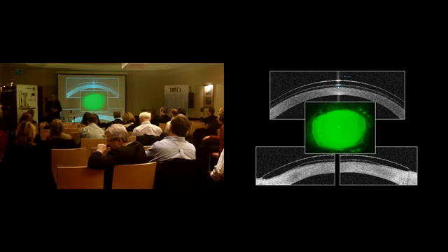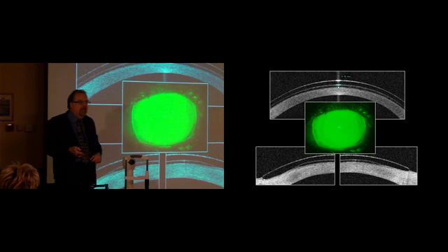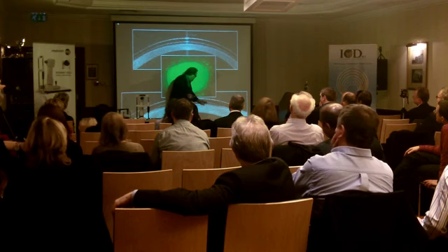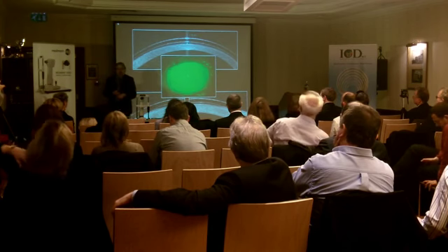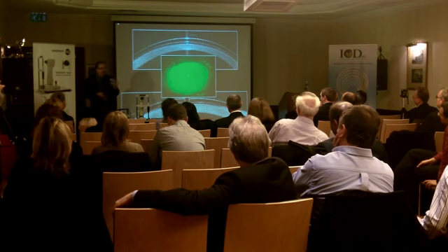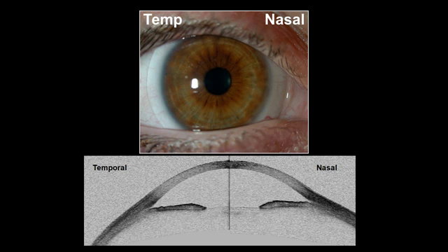So this is the same basic principles as the 16.5 lens. It's just that we've shrunk everything down a little bit. Still, our ultimate goal is to clear the central and peripheral cornea. So here again is another one of those modalities that you can use when the 16.5 is inadequate.